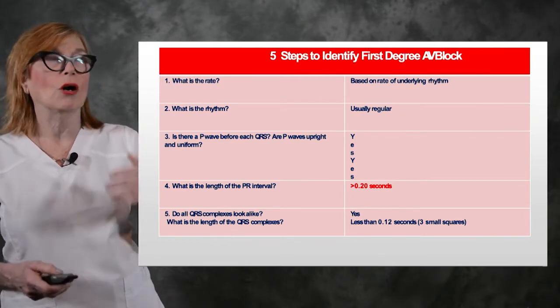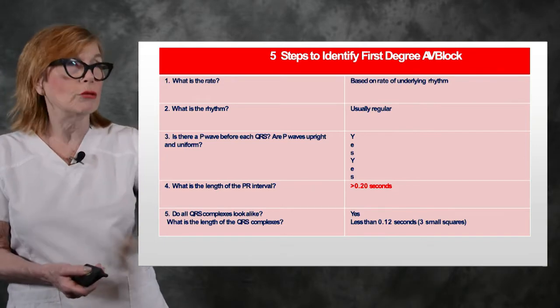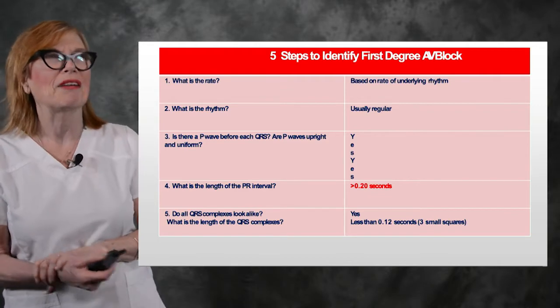It's very straightforward. Everybody here knows how to evaluate that, or at least if you used to actually measure it yourself, you actually know how to evaluate it.